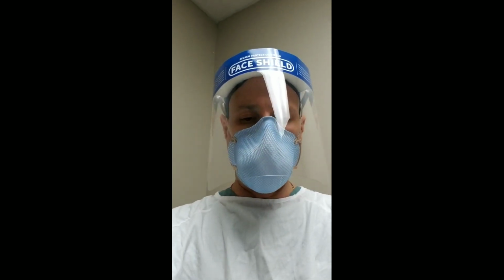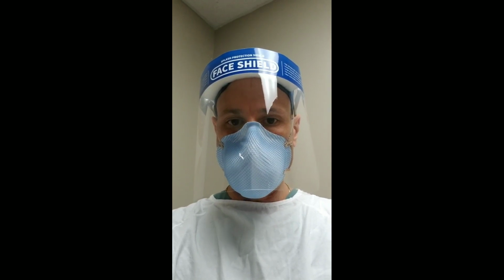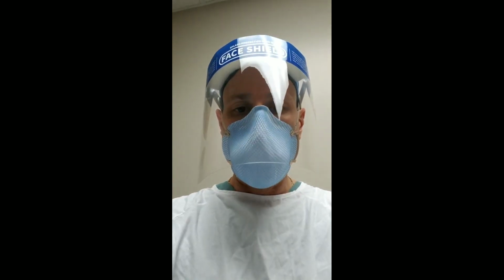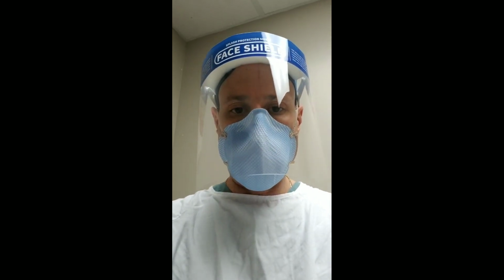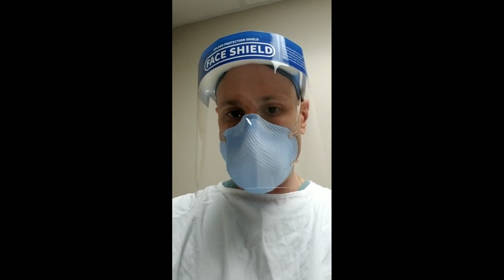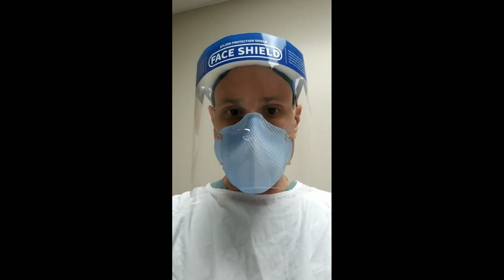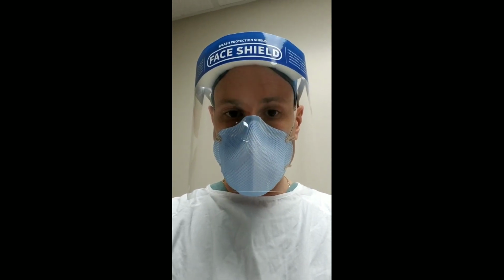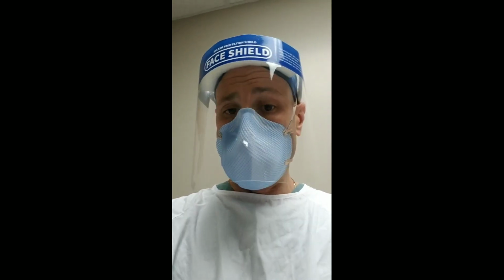Once the mechanics are done and the tomography is done, we're going to give a trial of APRV. The mode is called PC-APRV, and it's with the Drager vent. What's good about this is that we don't actually set a P low and we don't set a T low. We set the P high and the T high, and we use auto release, which terminates the expiration by looking at the peak expiratory flow, and we set a percentage.